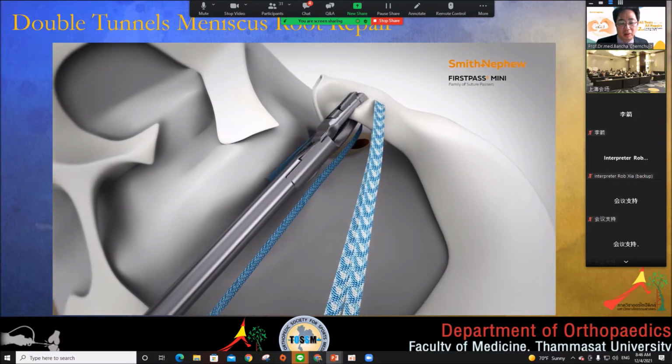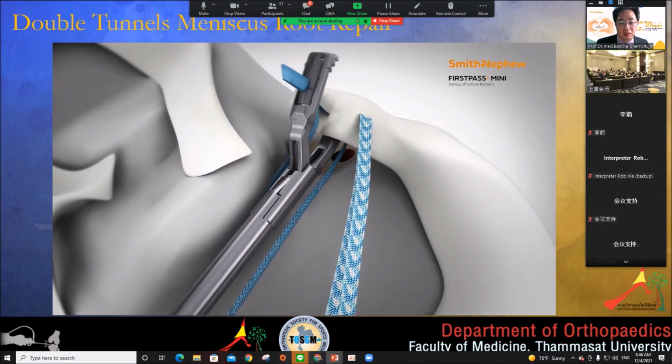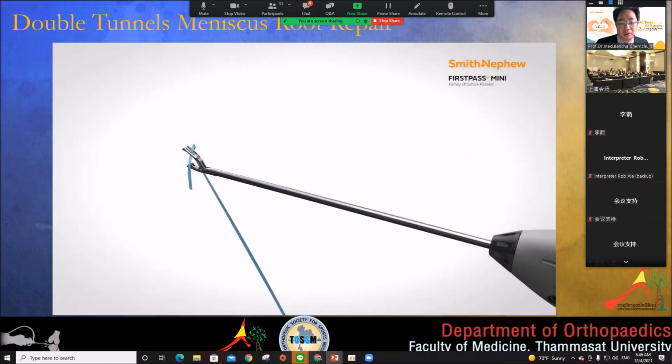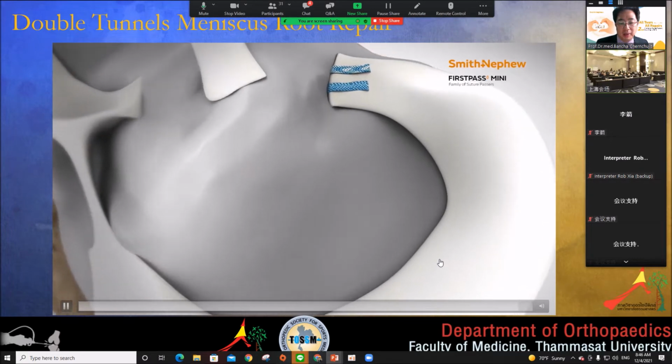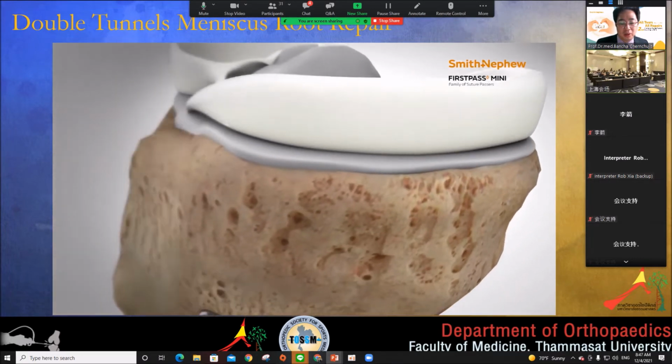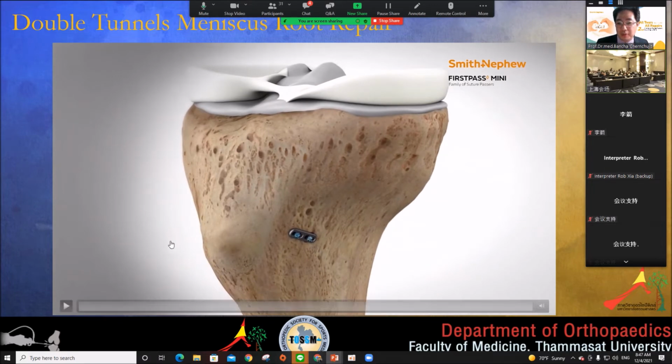Okay. Monofilament may be used to shuttle the sutures down the anterior and posterior tunnels. So this is what they use to complete the repair, tie the sutures over an endo button. Over the button, like that. Okay. So that is the technique proposed by Laprade.